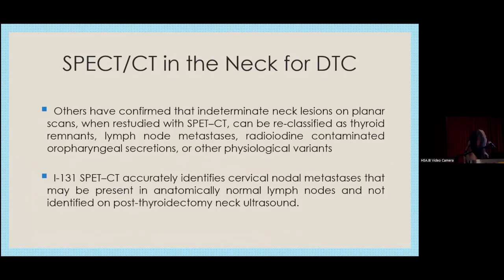So when we do SPECT-CT in indeterminate neck lesions which we see on planar scans, we restudy with SPECT-CT and you can reclassify them as thyroid remnants, lymph node metastasis, radioiodine contamination, oropharyngeal secretions, or physiological variants.